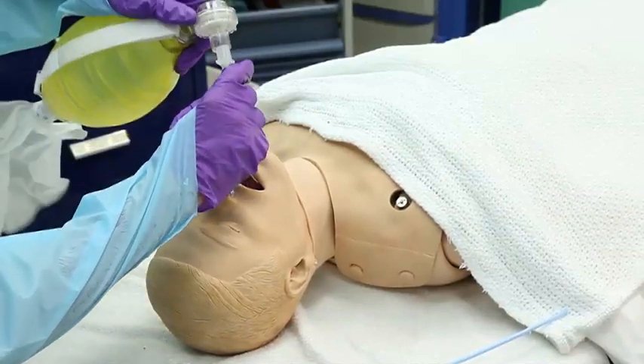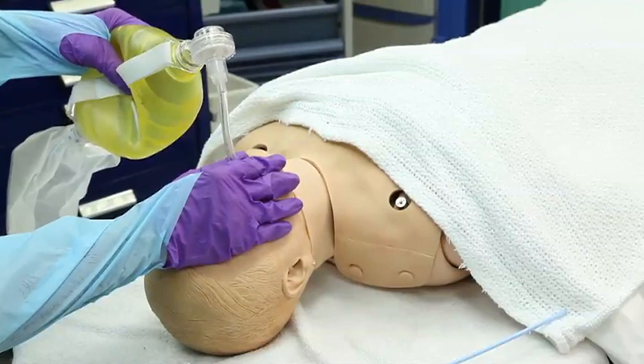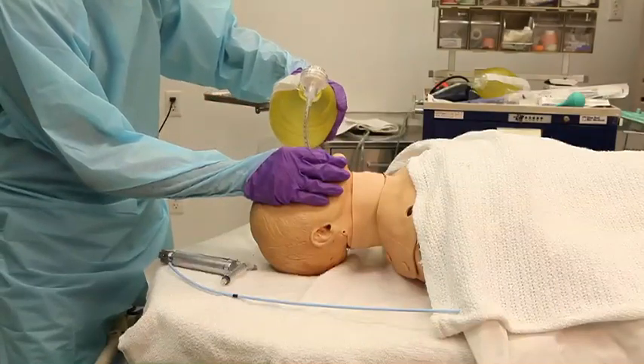Remove the gum elastic bougie, inflate the cuff, start ventilating the patient, and confirm proper tube placement using standard techniques of auscultation, carbon dioxide monitors, and chest x-ray. Take care.